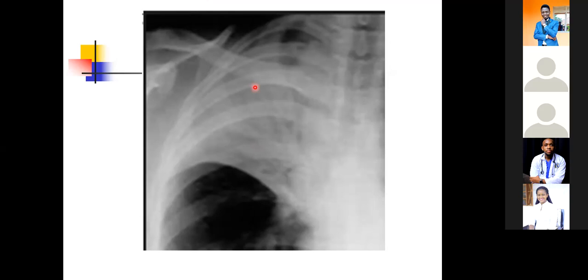I hope that now explains to somebody who asked about the air bronchograms, what it is. Similarly, for Mr. Kintu, who asked about silhouette sign. When we were doing the introductory session, we made a definition of some terms. And when we were particularly addressing the characteristics of an image, we defined one of them as being contrast.